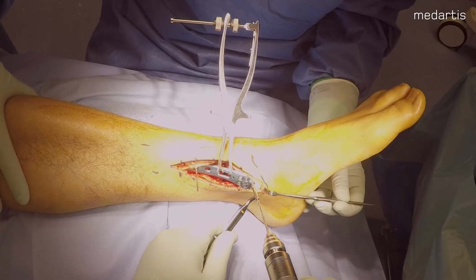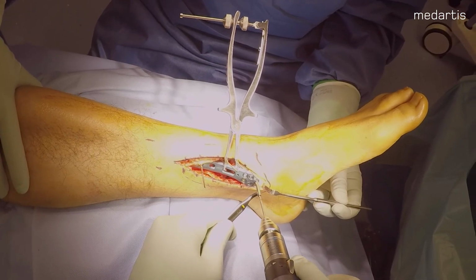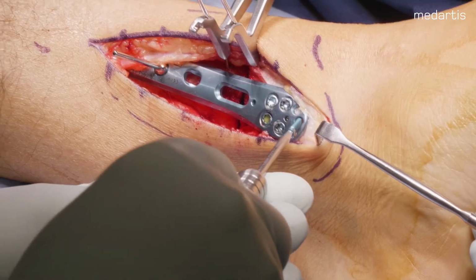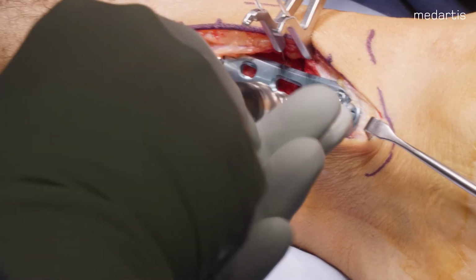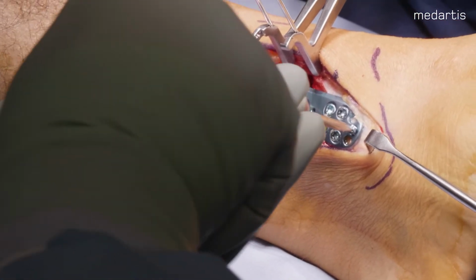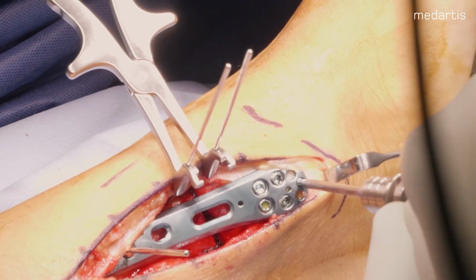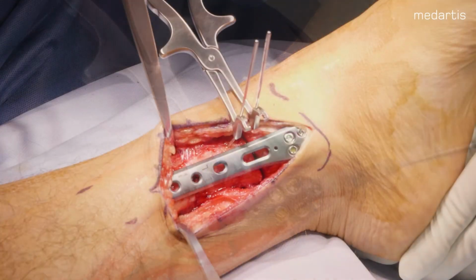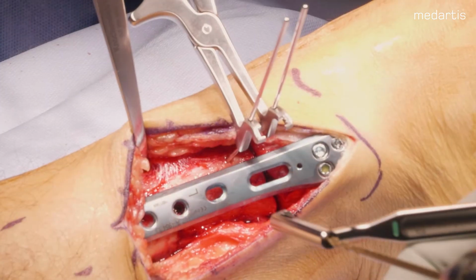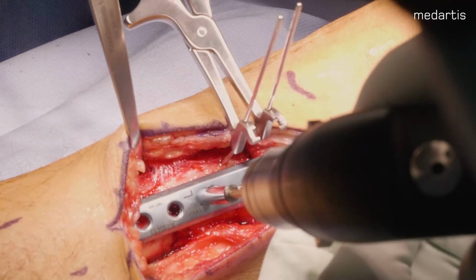Distal 2.8 TriLock screws help to adapt the plate to the bony anatomy. The oblong compression hole is used to obtain compression using a non-locking cortical screw drilled eccentrically using the appropriate drill guide.